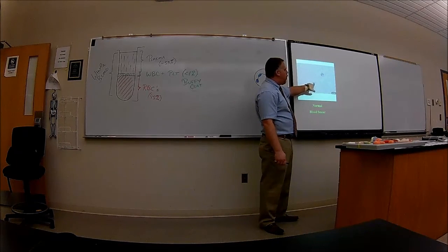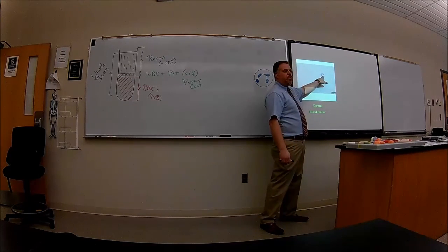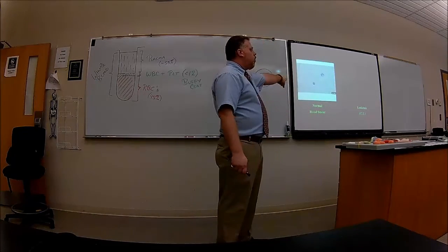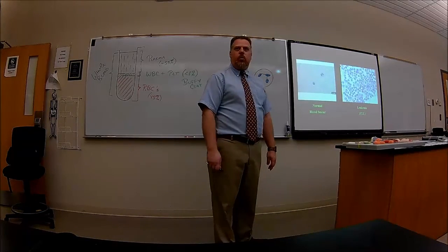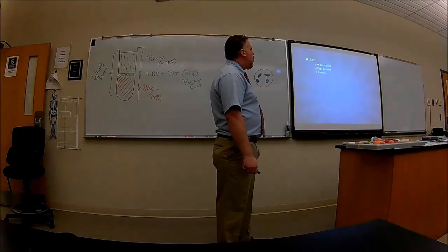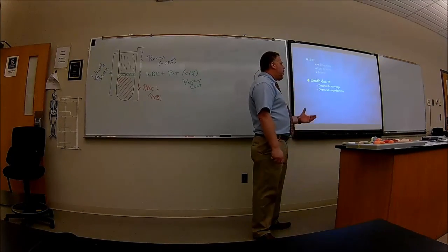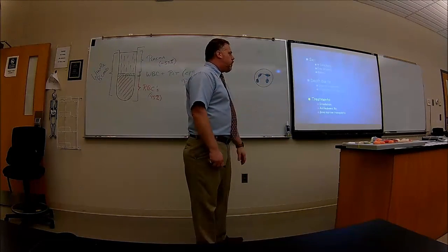Lymphocytes. See, the nucleus is not lobed, it's filling up most of the cell. I know people in the back can't see. This one over here, neutrophils, see, they're not too bad. But that's normal. This is not normal. Do you see all the white blood cells there? All right, so that's what will happen. Like I said, infections, easy bruising, anemia, death. They usually have overwhelming infections, internal hemorrhage, and there are different treatments, which I won't talk about.